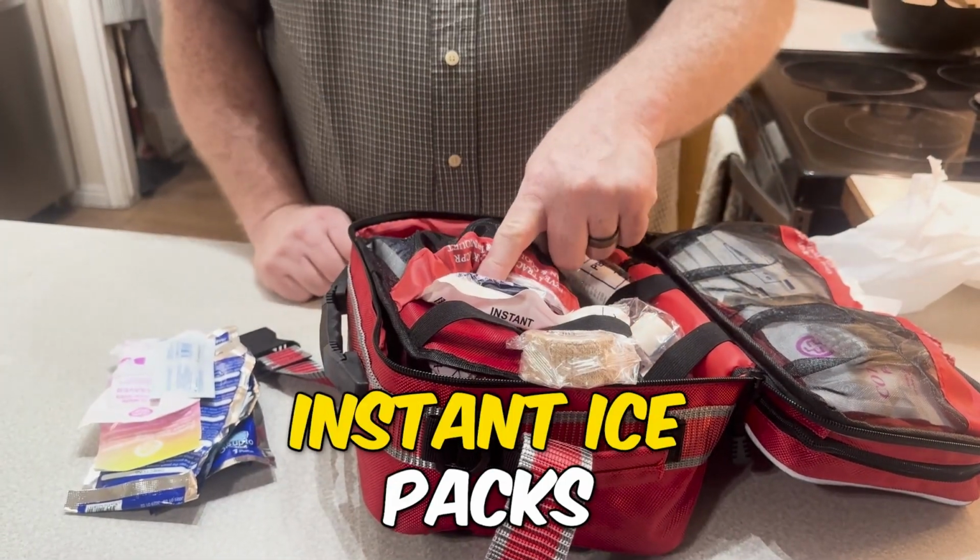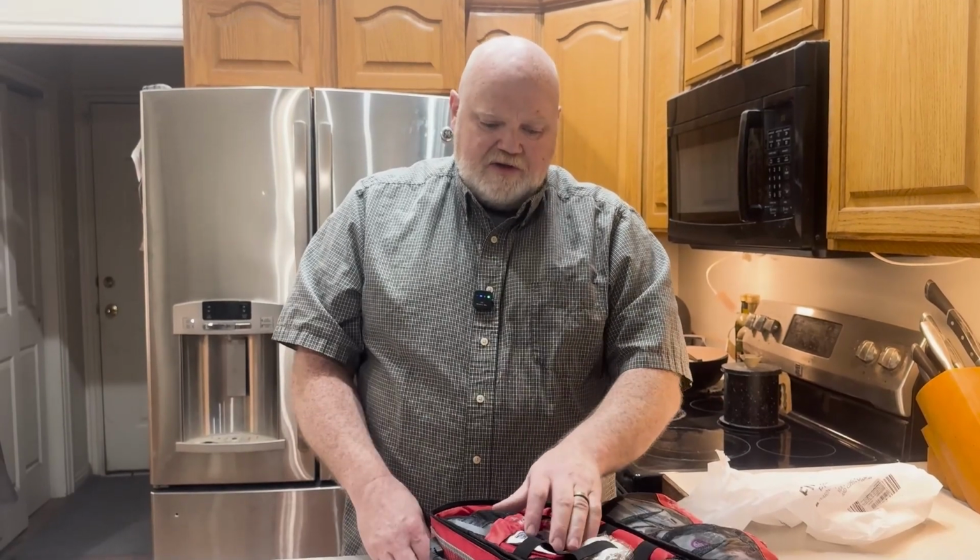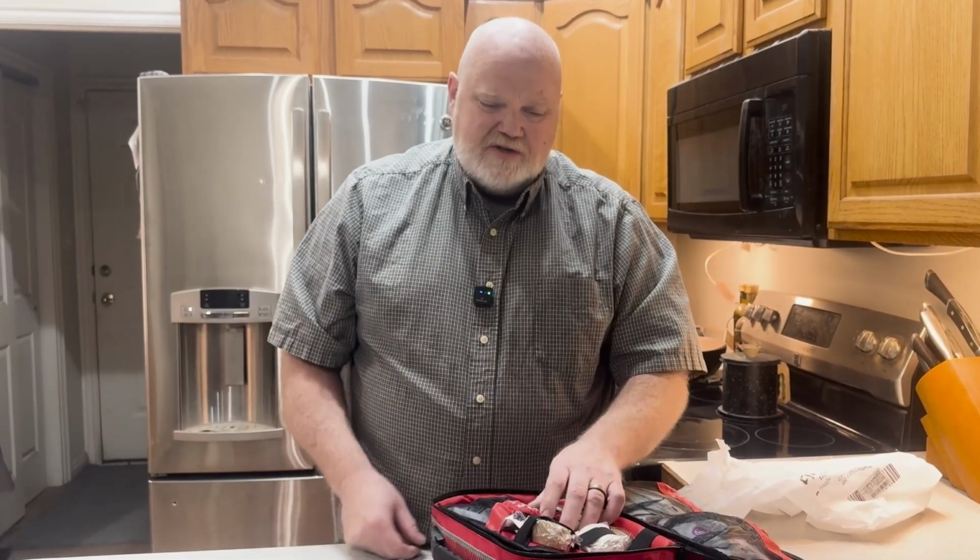You gotta be careful with these. In my jump kit, my EMT jump kit, I hadn't used it for a while. It had been sitting in my truck and the heat and everything. And anyways, the chemical exploded and it ate up and corroded my zippers and ruined my case, which was not good. So you gotta be careful with those. I don't like those as much as I used to, and they only last 10 minutes anyways. So that's your ice pack.